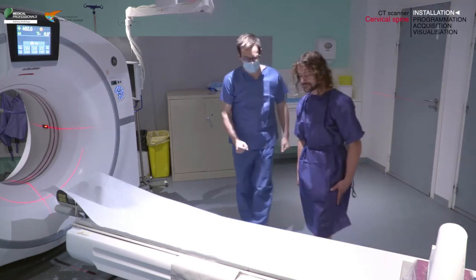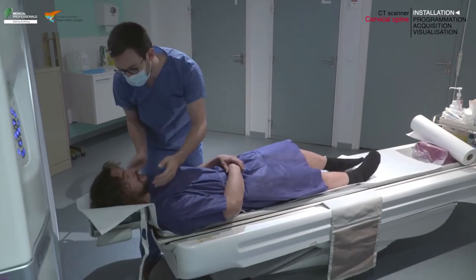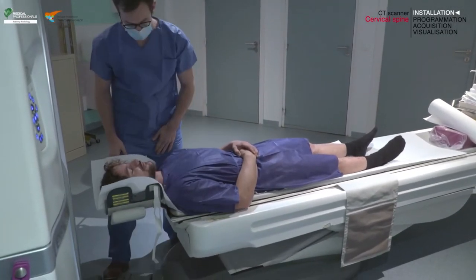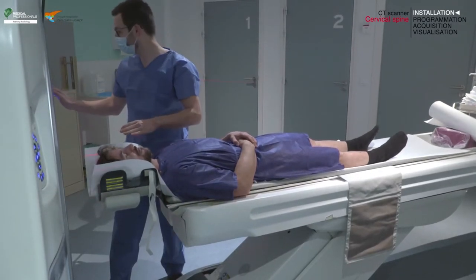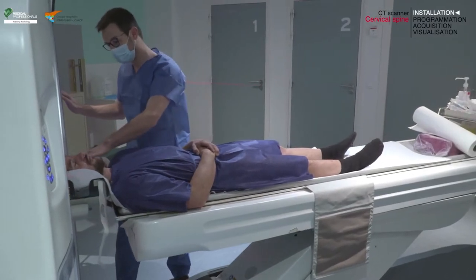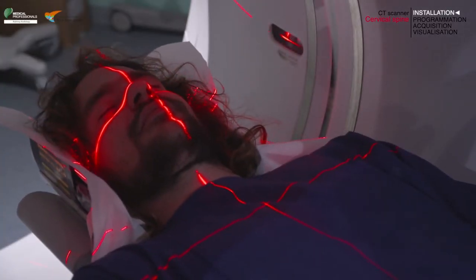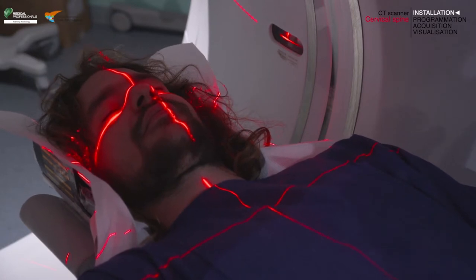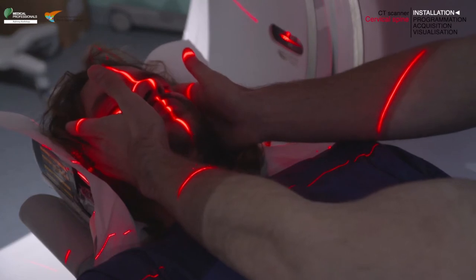After verifying the patient's identity using at least two identifiers, such as first and last name and date of birth, place your patient in a supine position with their head settled in the head holder and their arms resting along their body. Center the internal axial plane laser light on the appropriate landmark. Here we use the external auditory meatus, or EAM.